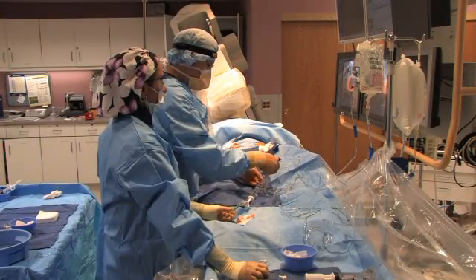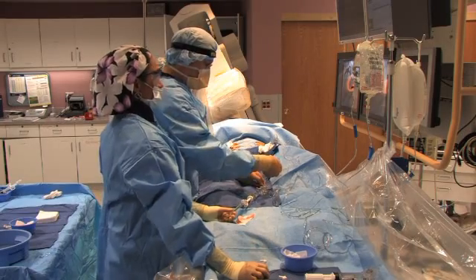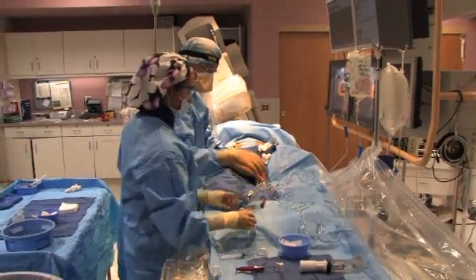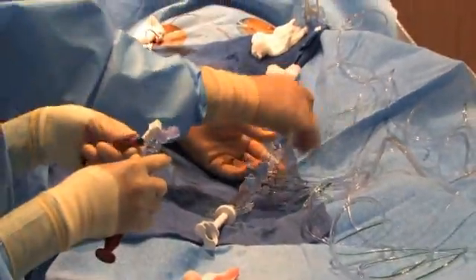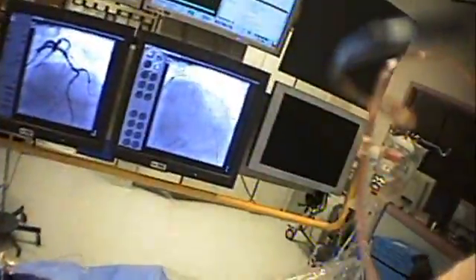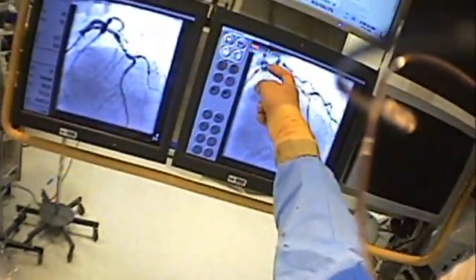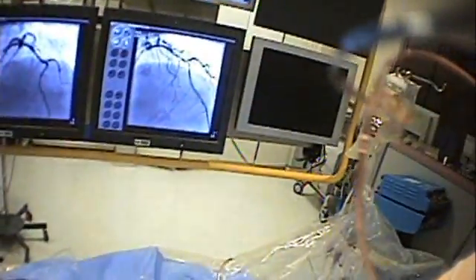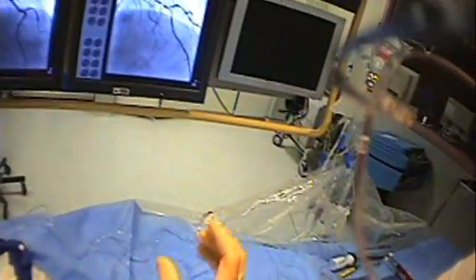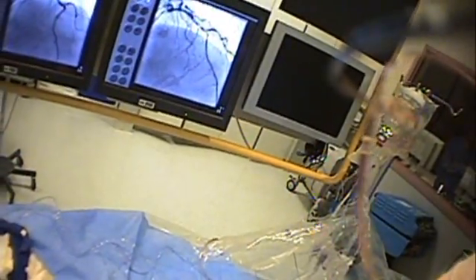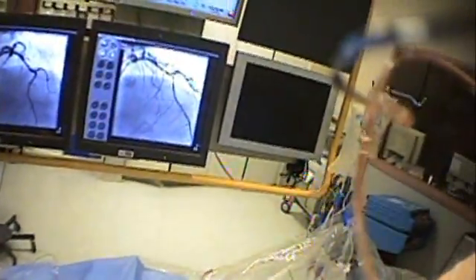This is nitroglycerin going right down the coronary — right down into the left anterior descending artery — and it expands that vessel, relaxing the muscular lining. The left anterior descending artery is more prone to develop re-narrowing. The earlier in the vessel — the closer to the beginning — the higher the chance of re-narrowing. This is in the first third of the vessel, but not extremely close to the origin. It's also a big vessel in diameter and a very short narrowing, so the chance of re-narrowing is relatively low. Increasing the risks are the fact that it is a left anterior descending artery and that this patient has diabetes and some mild kidney disease.